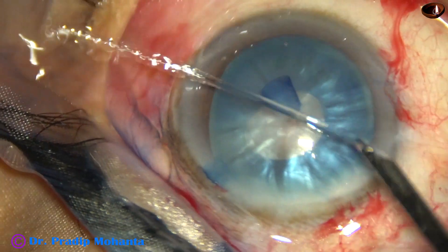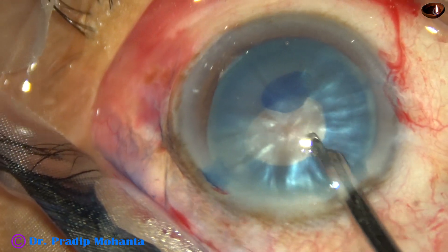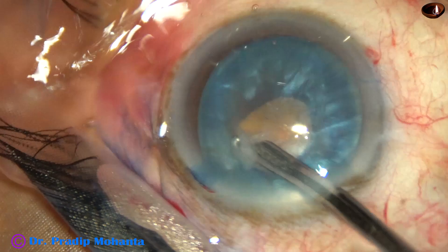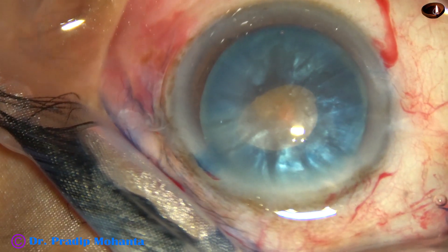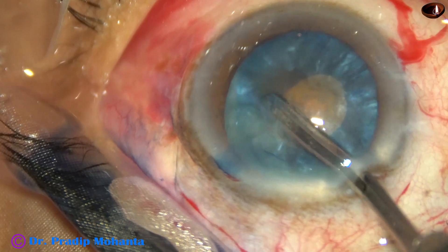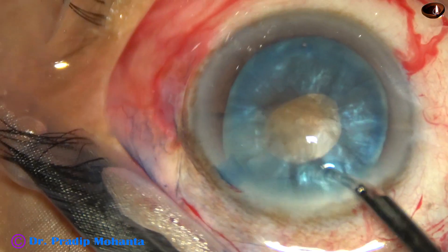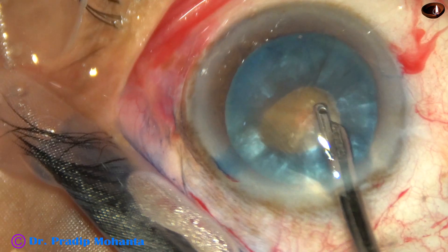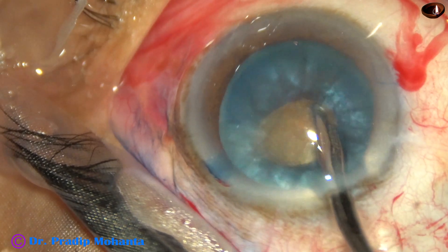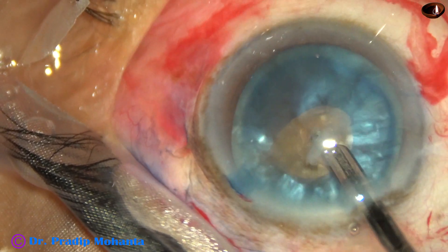My plan is to remove some cortical matter so that intralenticular pressure reduces. With the help of this 23G Simcoe, I am removing some cortical matter. First, I aspirated some cortex. Then, I am just tapping onto the nucleus — gentle depressions or gentle bellowing. And see, large chunks of cortex are coming out through the main incision.